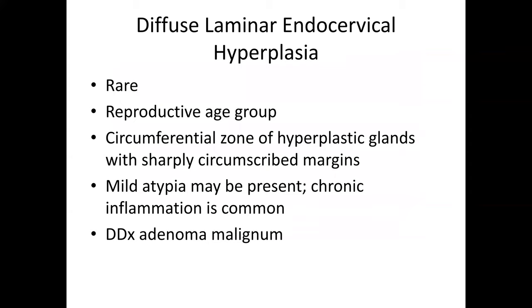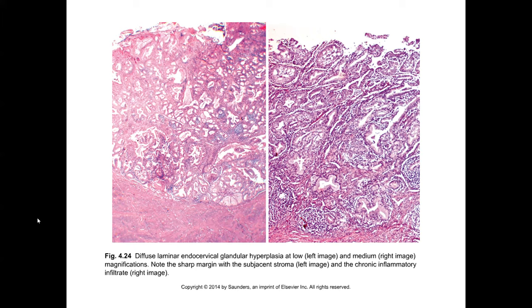Diffuse laminar endocervical hyperplasia is defined as a circumferential zone of hyperplastic glands with very sharply circumscribed margins. A little atypia may be present, some chronic inflammation is commonly seen, and occasionally this enters the differential of adenoma malignum or a very well-differentiated endocervical adenocarcinoma. We see clustered lobulated glands with very sharp demarcation, not much atypia, normal cytoplasmic mucin, and chronic inflammation. The scattered foci of lymphocytic inflammation are a very helpful feature in these lesions.